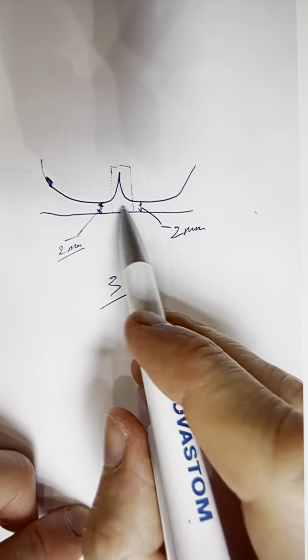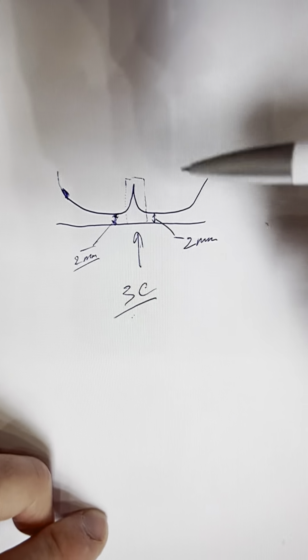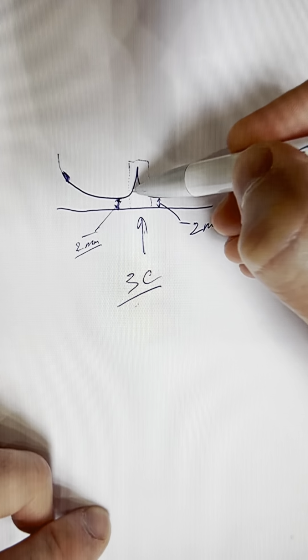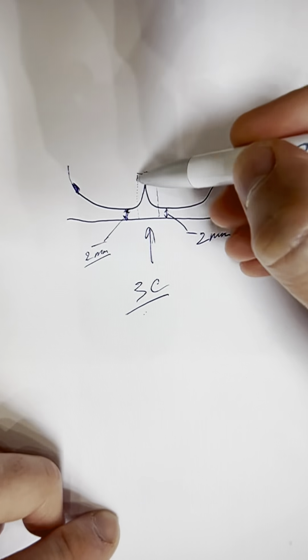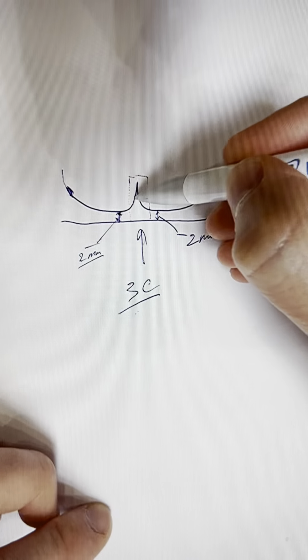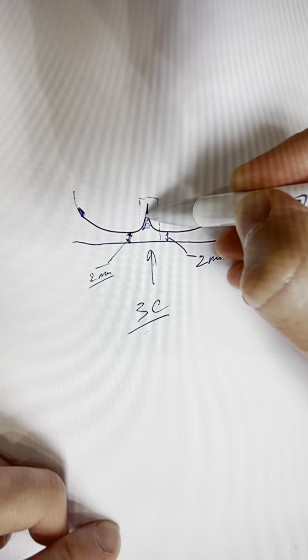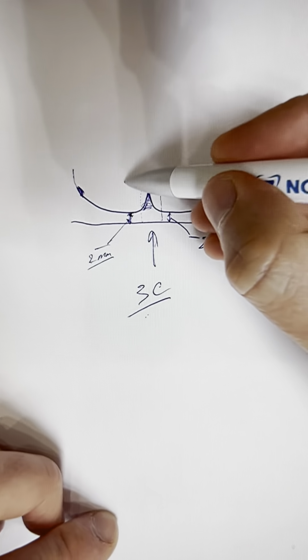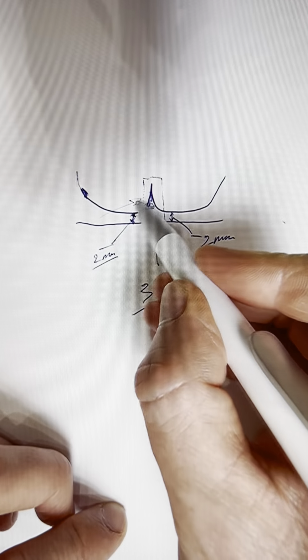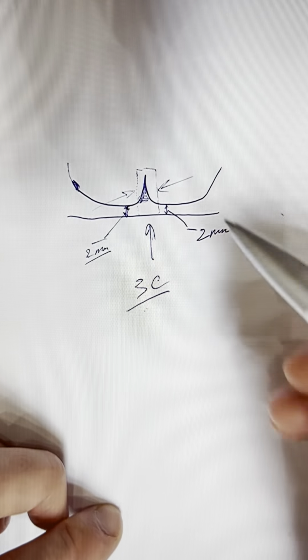problem. We have to place an implant only in this projection because we have also antagonist tooth, and we should be directly in this septa. The essence of the problem is that when you work with the drills, you will expand under a certain diameter of the implant. So you will constantly have the feeling that you are in a bone tissue because you will always rest against a part of the septa with a drill.